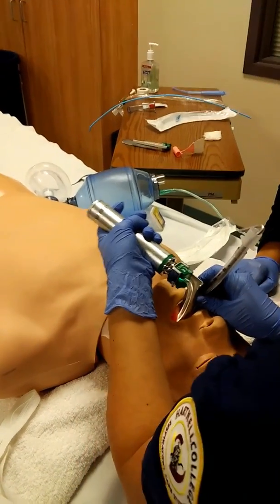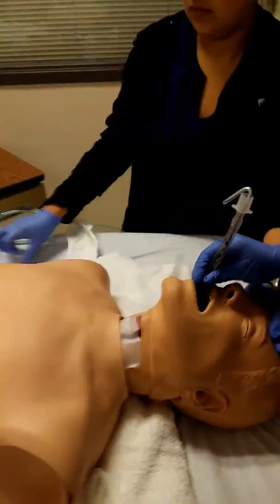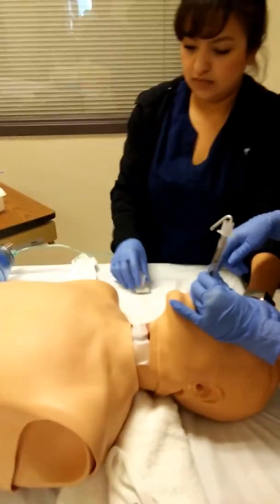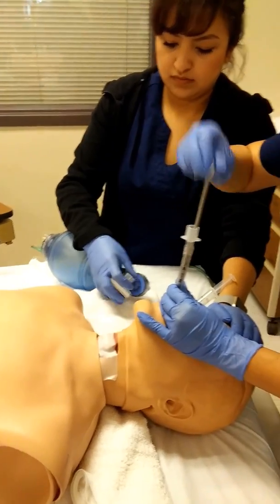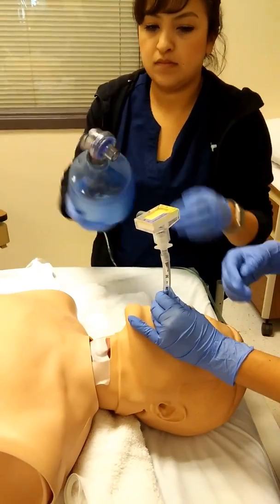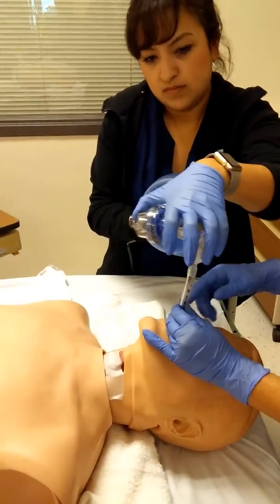Okay, so you want to be careful when you're removing the laryngoscope. And my partner just inflated the cuff, and I'm going to go ahead and remove the stylet. Okay. And then I'm going to make sure that there's correct placement of the tube.